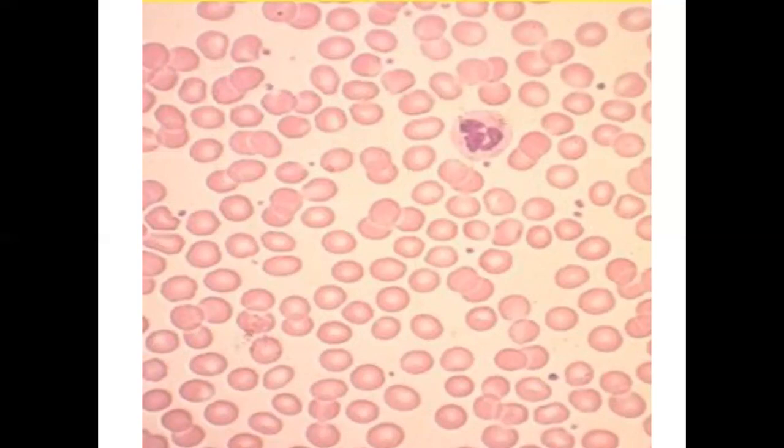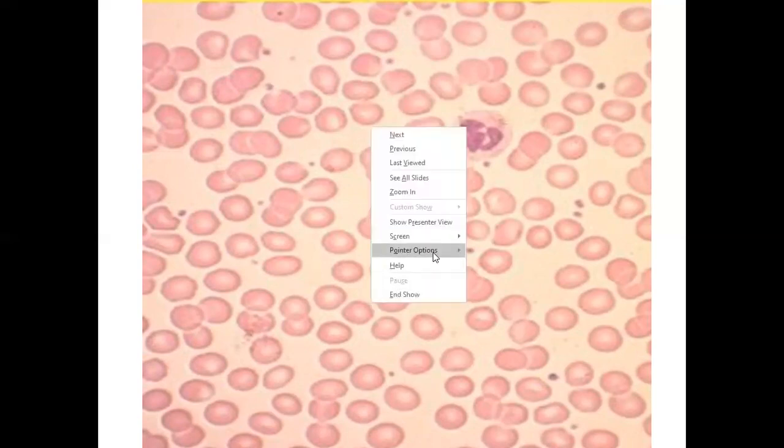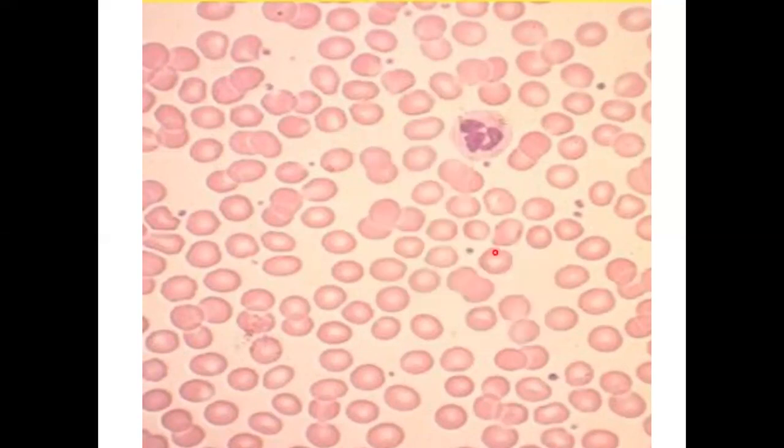Like in this example here, what we are seeing is a blood smear. We see these cells, almost of equal size. These are red blood cells. The blood smear will be filled mostly with red blood cells. In the central portion, the majority of the cells are red blood cells. White blood cells are large, so usually they are pushed to the periphery as you are smearing the blood. These are red blood cells, otherwise known as red corpuscles.